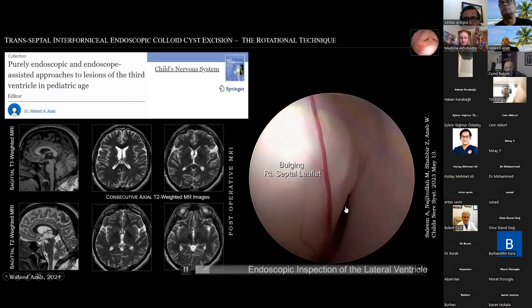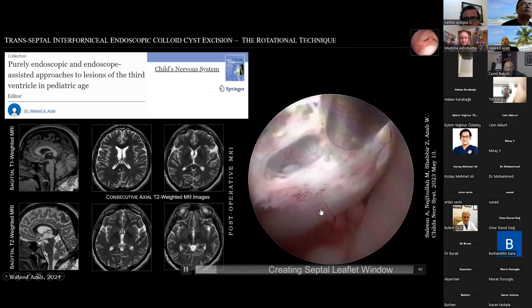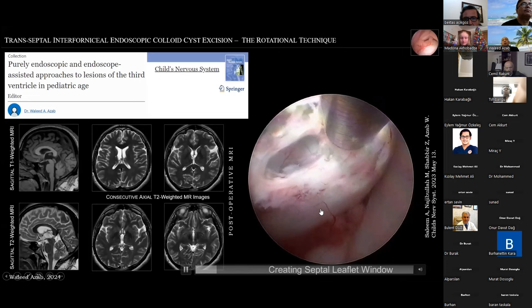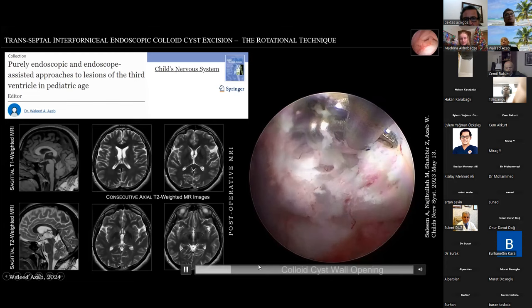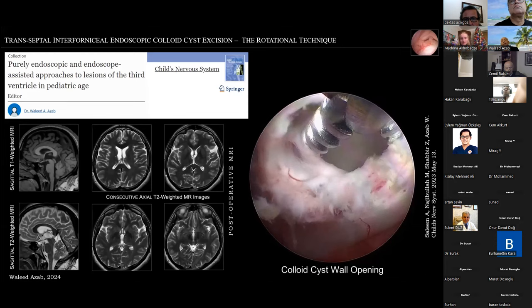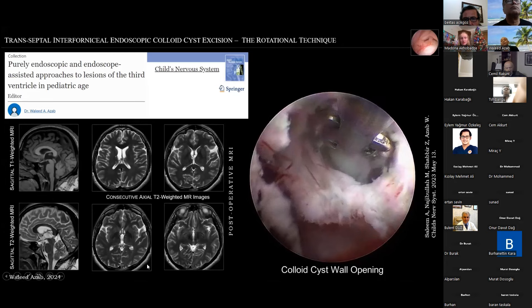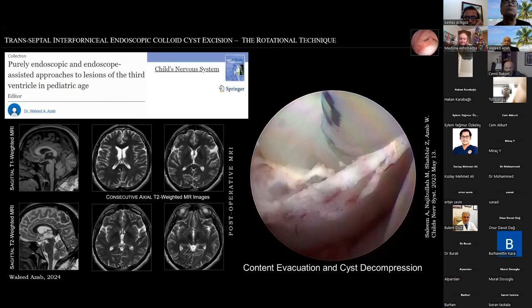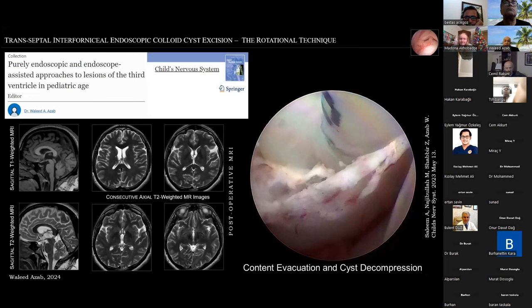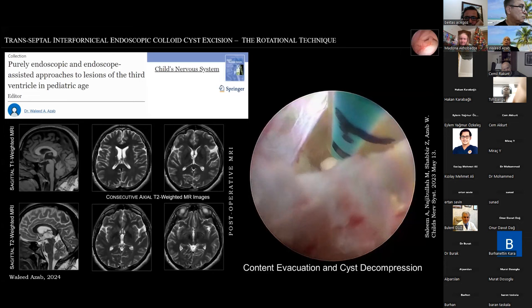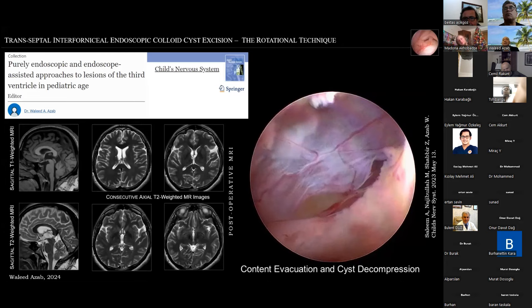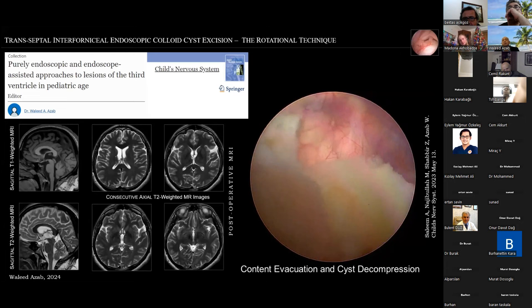Here is the video of that case. The foramen of Monro is very occluded and obstructed, with the bulging right septal leaflet from the tumor. A septal window is performed in the leaflet of the septum pellucidum using the bipolar — initially opened, then forceps used to enlarge it and open the wall of the colloid cyst. The content is shown, and then the Nelaton catheter with beveled end and controlled suction is used to debulk the components within the colloid cyst. Solid material that is not suctionable is destroyed using the forceps and then aspirated.